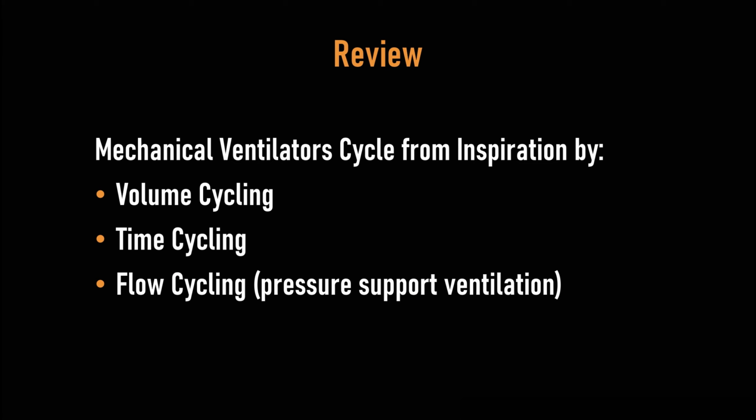Let's wrap this up. This particular tutorial looked at ventilator cycling. Mechanical ventilators cycle from inspiration by volume cycling in volume control ventilation, time cycling in both volume control and pressure control modes of ventilation, and flow cycling, which is specific to pressure support ventilation.